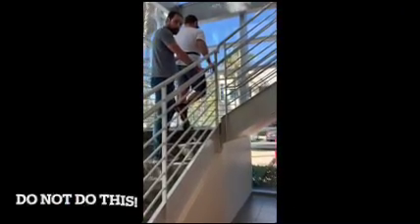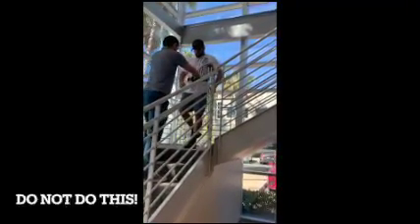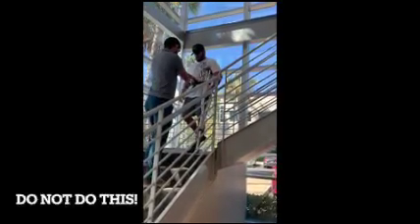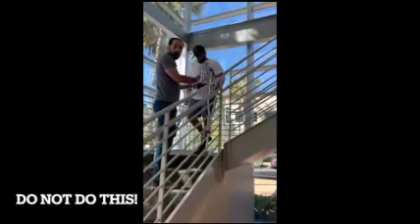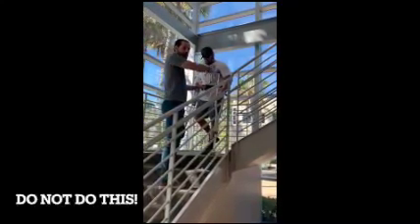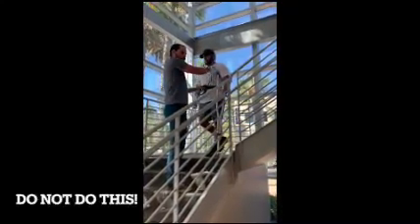The reason I say now he only had a railing on one side in particular, and we're going to come back down. Go ahead and turn for me, patient. You're going to turn around, and we're going to go back down on this side. See how this is kind of awkward, like I'm spinning my patient around. Now switch your device side. There's a lot that could go wrong right here, which is why you have to go up onto the landing with your patient. So go ahead and turn again, you can put your foot down.